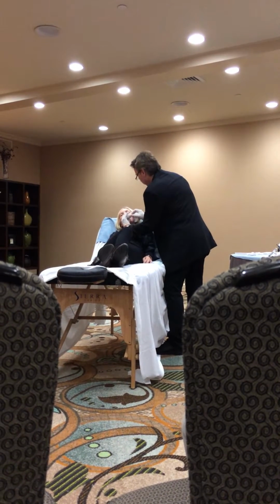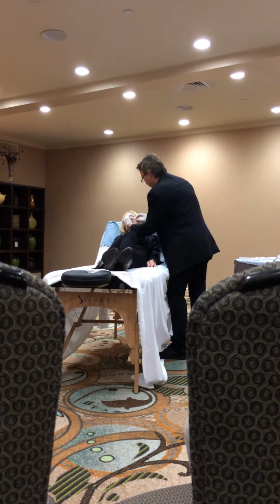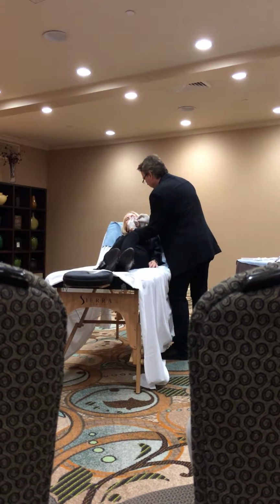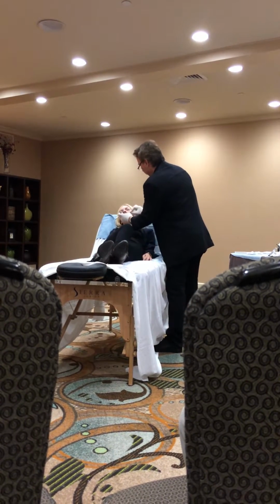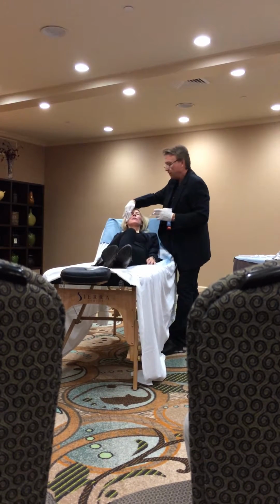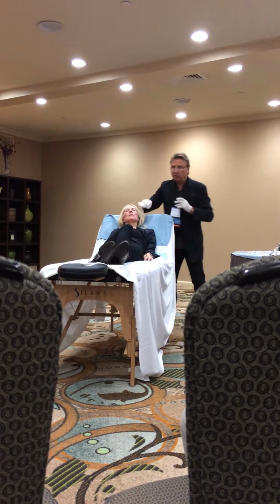Tom, do you stack the depths of it or just put it all in one? Yes, I do that too. In her, I'm just, like he said, going about a quarter inch, going in and pulling out. Okay, so now what's this? How much massaging do you do in general, Tom? Not much. I just push like this. Just like I hold it like this. If you have any words of wisdom, anybody, you can blurt right out.